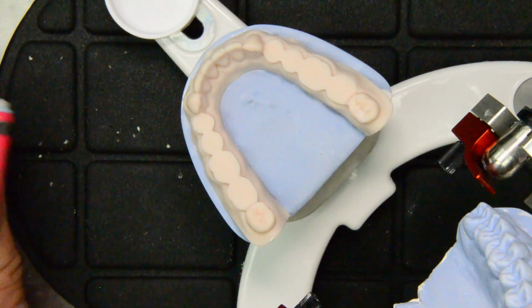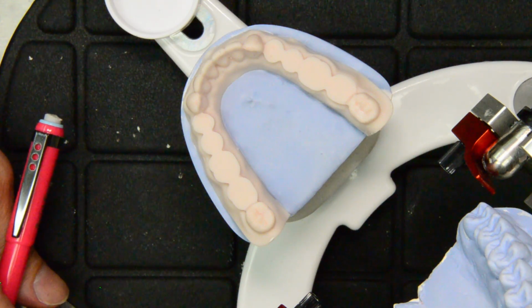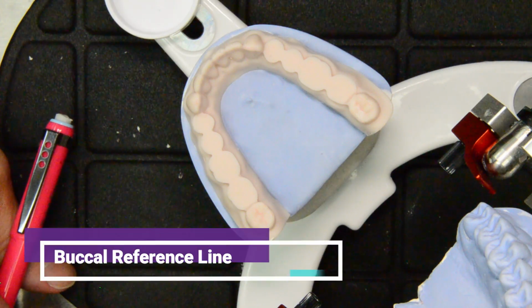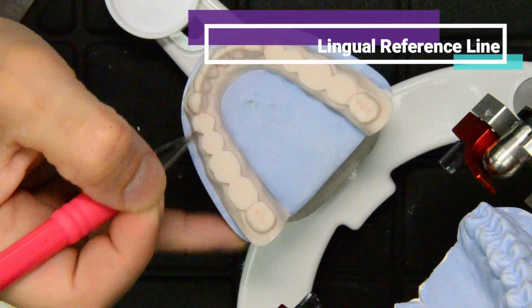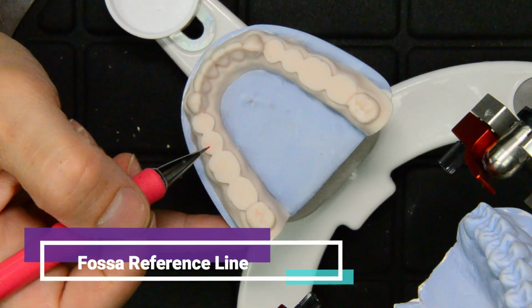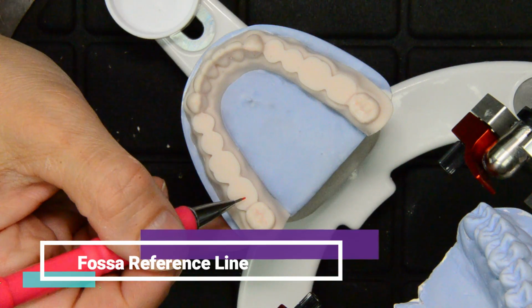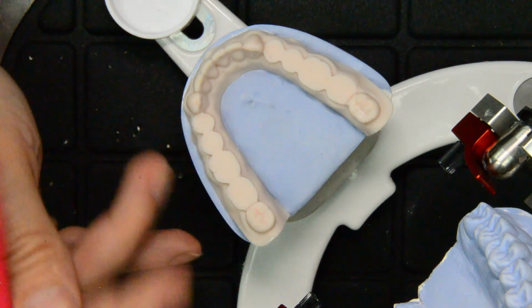The easiest way to start planning this is through the placement of reference lines. We have the buccal reference line on the buccal, and we have the lingual reference line on the lingual. And then we'll have the fossa reference line in the center.